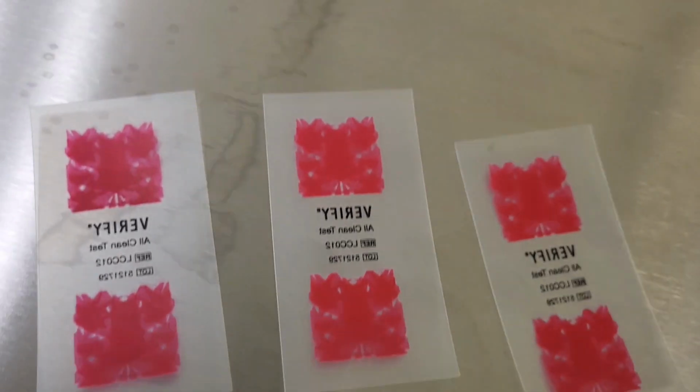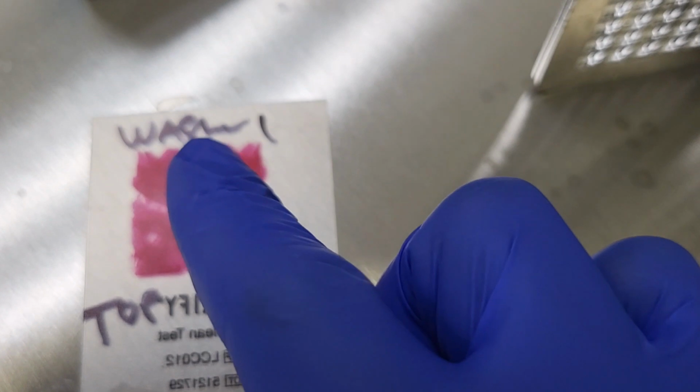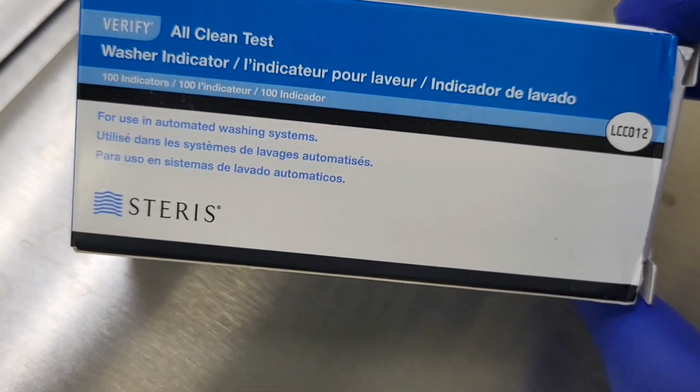I'll show you. So this is what it is. Washer, if it's on the top, bottom, or middle, the rack number, and the date. And this right here will leave. This is what it goes in right here. This is all sterile to verify. Let's go.